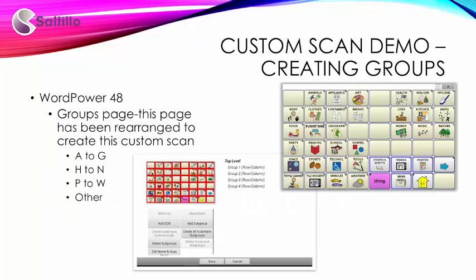Custom scanning patterns can be applied to a single page or an entire vocabulary. The need to create custom scan patterns will vary by vocabulary organization and client needs. To create custom scanning patterns, I will access the scan editor within the vocabulary program. For this demonstration, I will be using WordPower 48 with a single switch, block scanning, and auditory prompts set up in the settings. Customizing the scan will enable us to create more meaningful auditory prompts on the groups page.